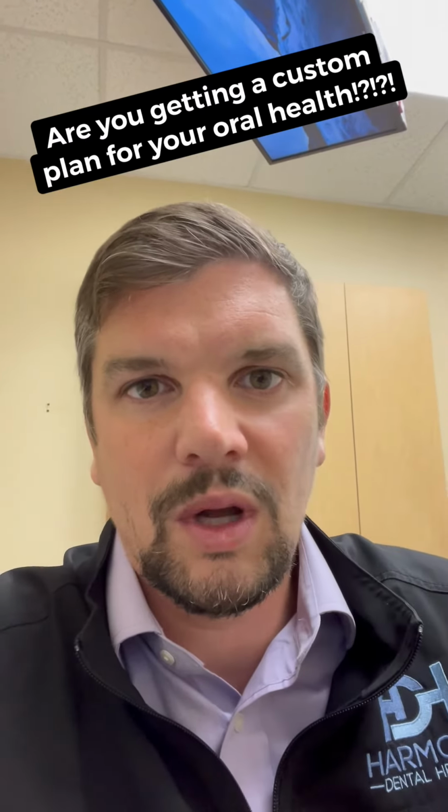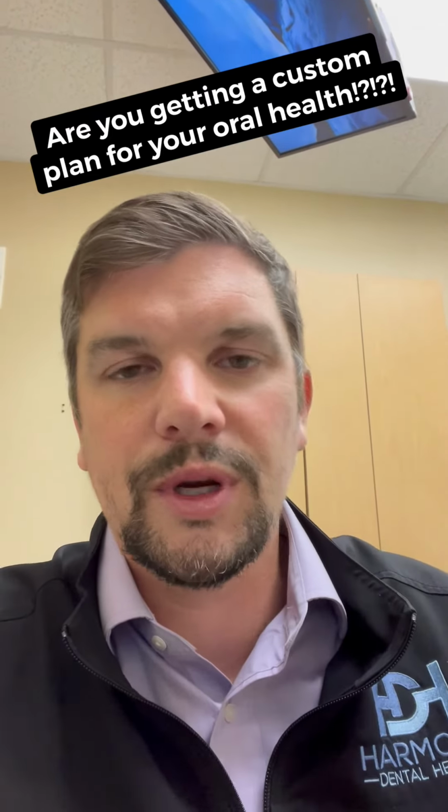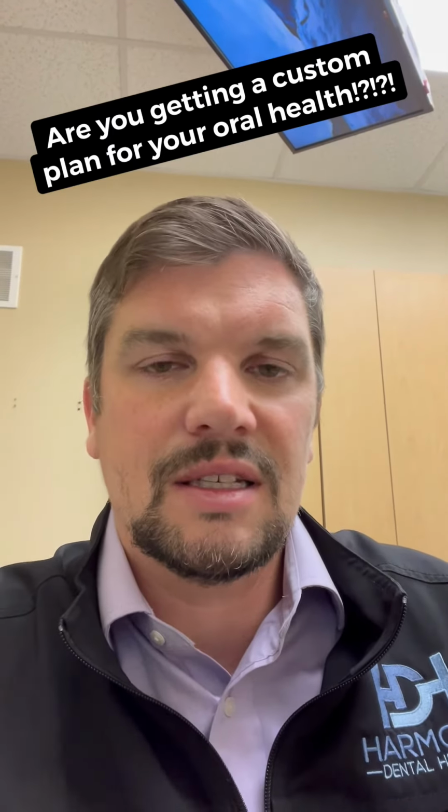And so without having this microscope, it's really hard for us to identify which bacteria are there. And without knowing which bacteria are there, it's hard for us to give proper recommendations on what these patients actually need to get back to a healthy state. Do they need more frequent recalls? Do they need additional biofilm removal therapy? What do they need? The bacteria is going to tell us a lot about what they need.